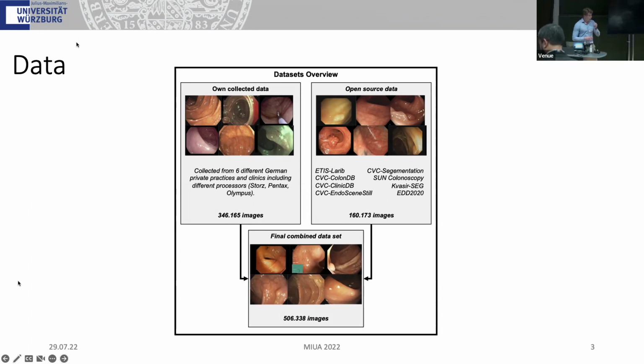For the project that I'm presenting right now, the endoscope with the additional cameras was used in an animal trial setting, because we only had approval for doing it in animals, not humans. So we had to create an additional data set with animal data and retrain the network. We first trained it on the human data and then retrained it on the animal data to get it running for the actual application.